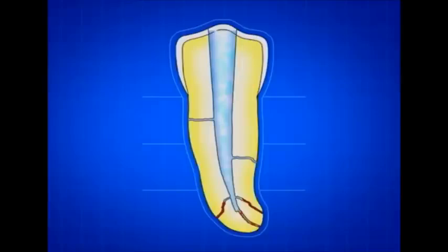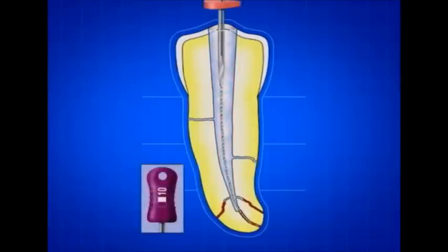introduction of pre-curved files. Once the tip of the pre-curved file is apical to the ledge, it is moved in and out of the canal utilizing very short push-pull movements with emphasis on staying apical to the defect. When the file slides easily, it is turned clockwise upon withdrawal, because this motion will tend to straighten the apical 1/3 of a stainless steel file and allow it to rasp, reduce, smooth, or potentially eliminate the ledge, which is typically on the outer wall of the canal curvature.